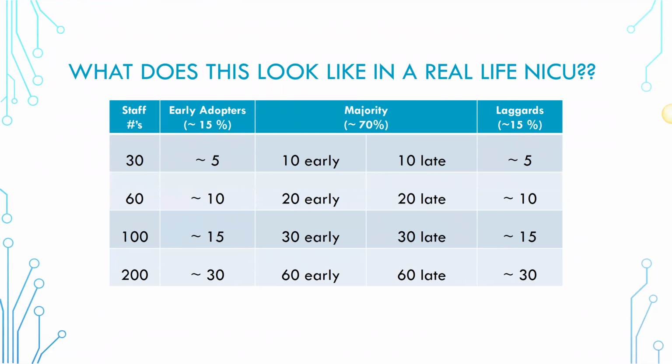And that's for a big head and a small head, because the 10-20 system is really based off of a 10%, 20% head circumference system, where the distance between electrodes are either 10% or 20% of the head circumference. But to make it easy, they made a decision to make 25 centimeter being a preemie head and 35 centimeter being a term baby head. And so that's how they came up with the width of these measuring tapes. And so we don't have to measure the head circumference or do any of that. We just use the term tool or the preterm tool, and it gets us in a close enough estimation.